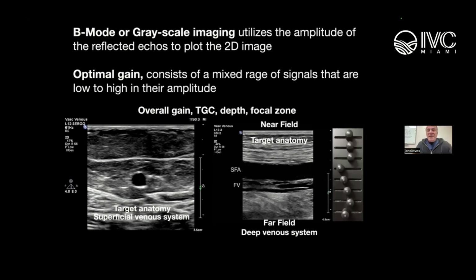Is that true, or can you adjust the actual frequency with a knob on the machine? Well, a linear transducer today on most commercial ultrasound systems allows you to change the frequency within that particular transducer. So if you have a bigger leg, you can go into a penetration mode or use a harmonic penetration. If it's somebody with a very small leg, you have the ability to change the frequency to a higher resolution. That's where harmonics comes in. And that's an adjustable knob on the machine, yes.